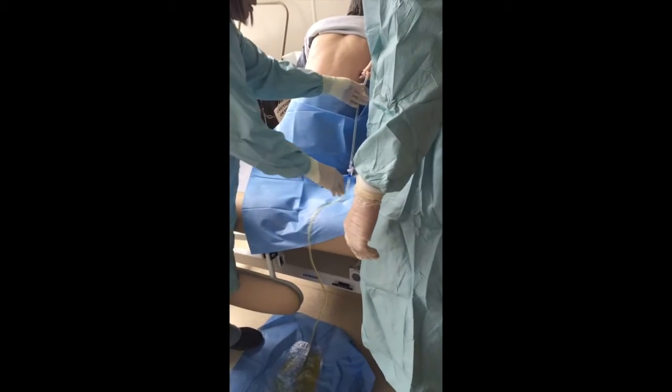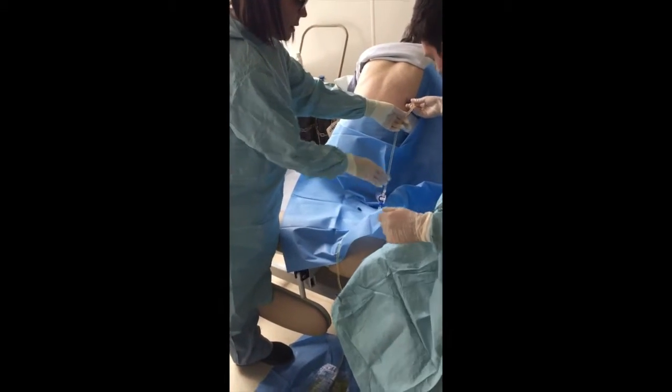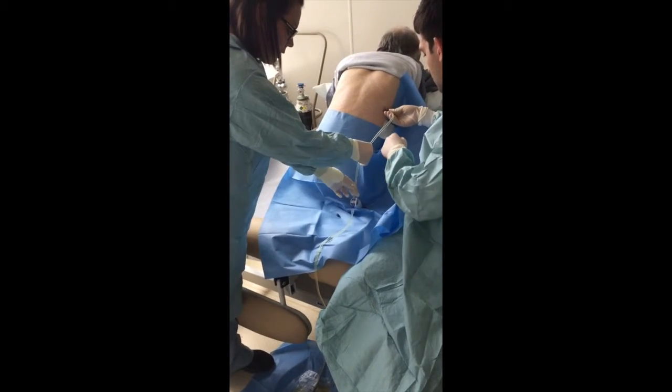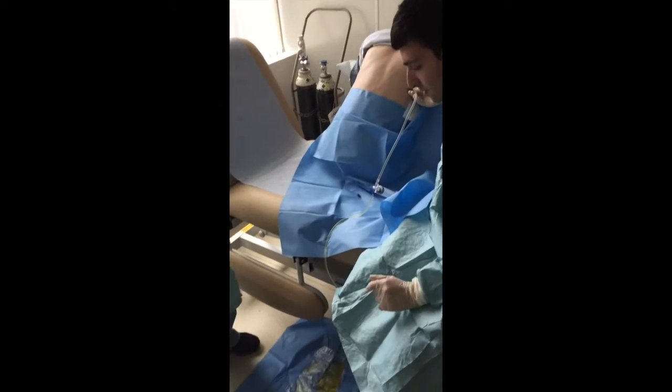And what you can do now, comfortable, take a seat on the edge of the bed there. So you're in a nice comfortable position, make sure your patient's okay, he's tolerating it okay. You're alright there, yeah? Yeah, fine. And then just that can drain into the bag.